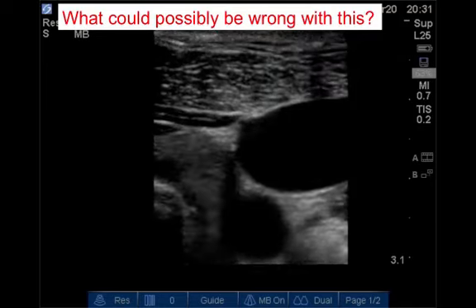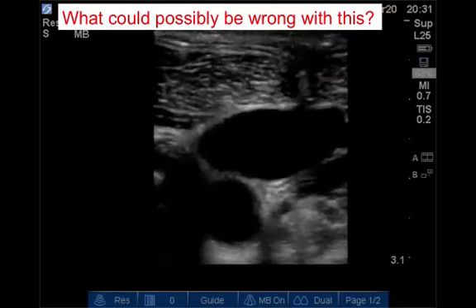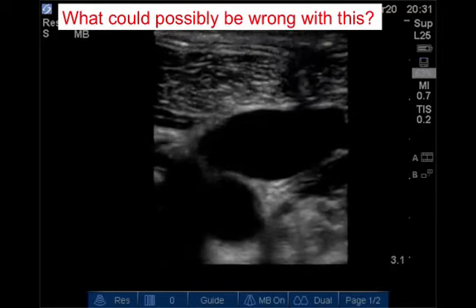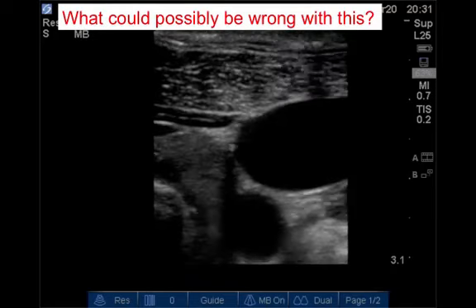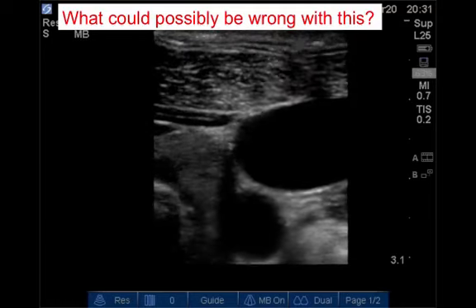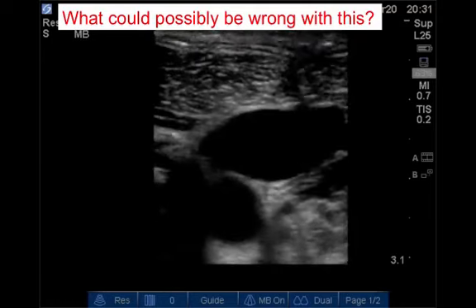So I would argue that this is not a satisfactory approach to vascular access, and that if this were my loved one, I would like you to know exactly where the piece of metal you are using to pierce the flesh and blood vessels is located, rather than simply relying on the trajectory that you can infer from this ultrasound-guided image.